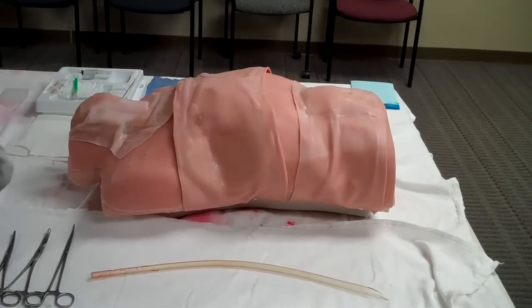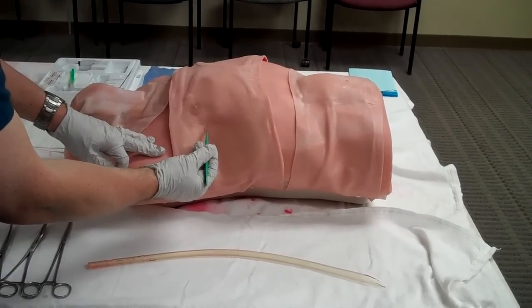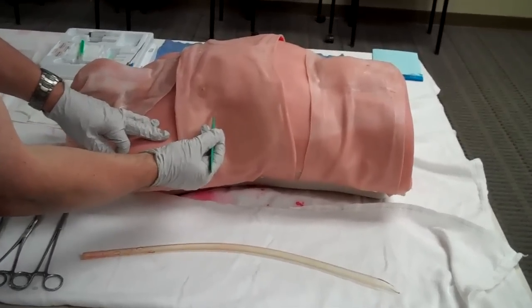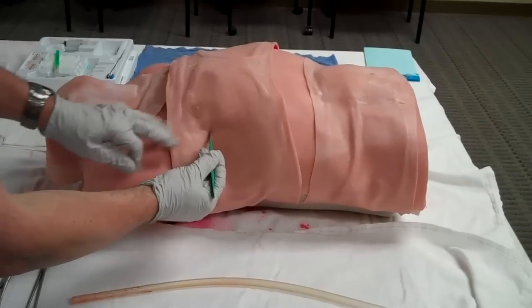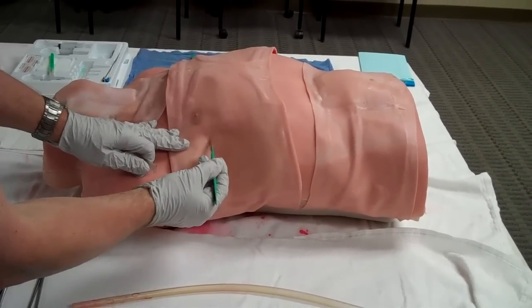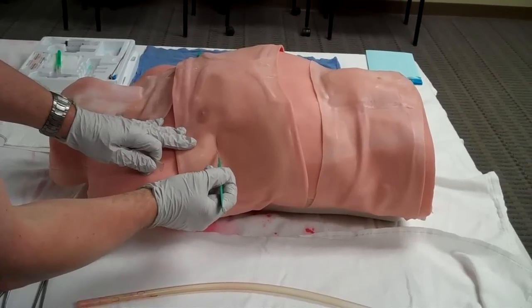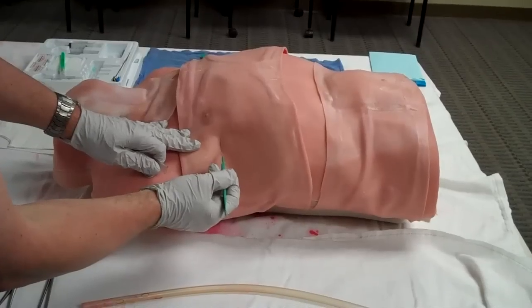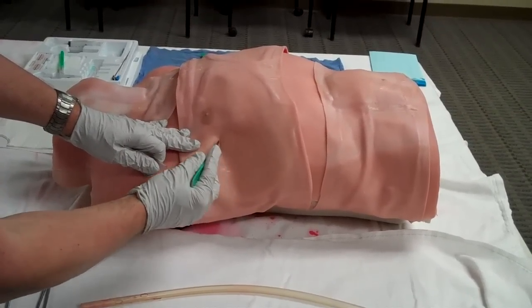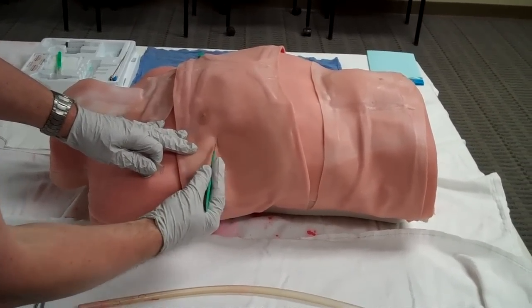anterior axillary line. Now, I prefer to use an incision that is perfectly transverse, and I'll just make this incision here. I prefer a 10 blade. Other people like an 11 blade. The incision needs to be big enough so that you can get your finger in and feel around, because that is another key part of this procedure. It usually needs to be about 3 centimeters in length, and you can kind of see that right here.